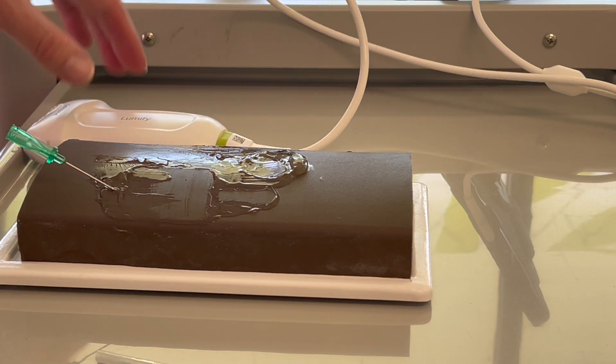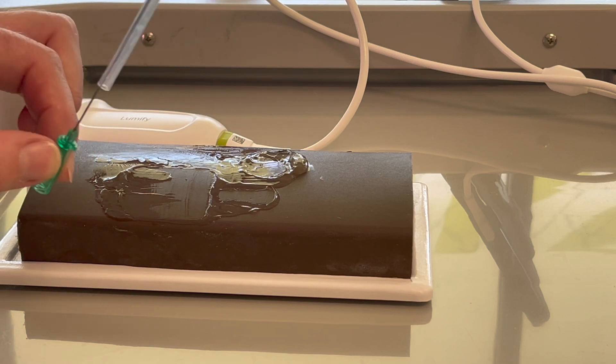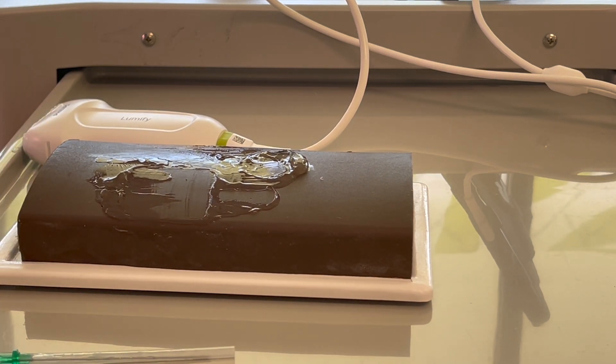Remember to wear gloves and practice sharp safety. If you are going to recap the cannula in training, do so with the one-hand technique, because it is possible to send the needle out the side of the plastic and into your finger.